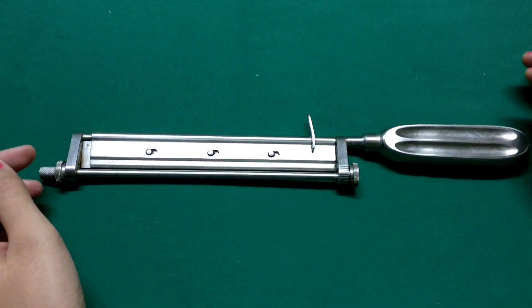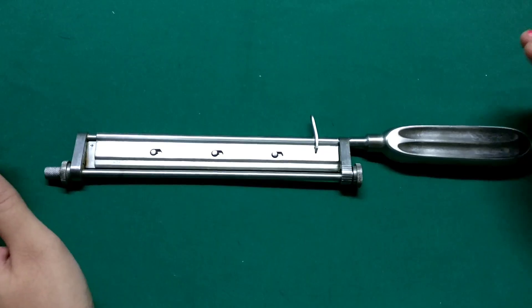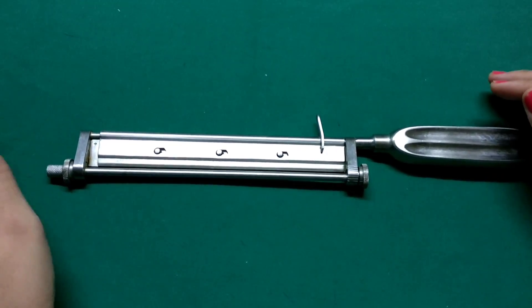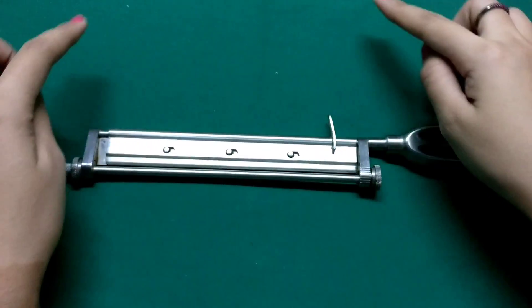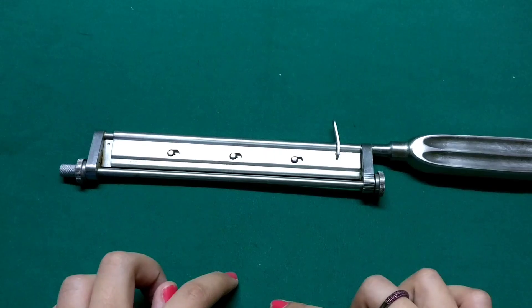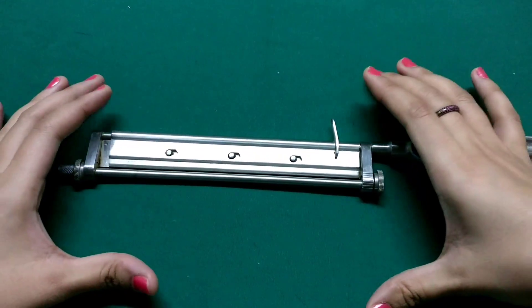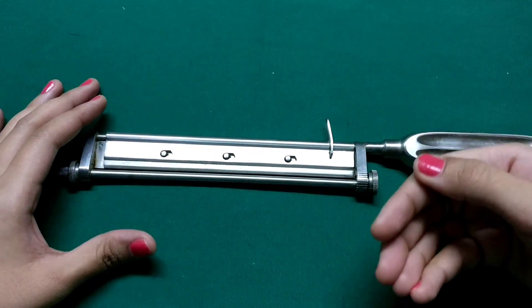This is called a Watson's modification of a Humby's knife. It's not the original Humby's knife as people might think. The original Humby's knife consisted of a rectangular frame on either side which would help to hold the skin in one place and then the graft would be harvested.